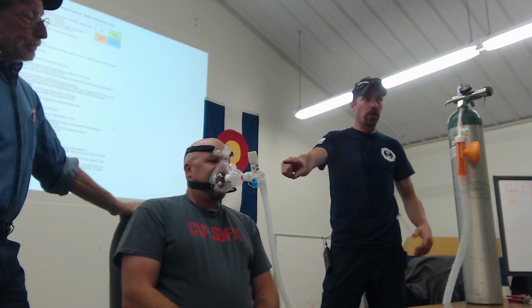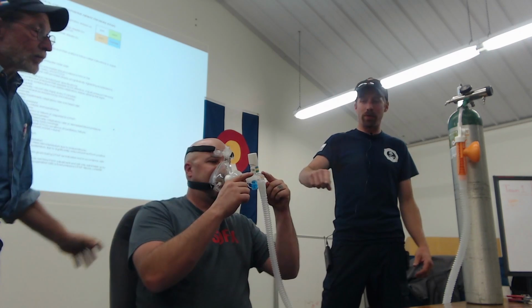And if you're counting respirations, this thing makes it super easy. All you got to do is watch that little PEEP valve. When it goes up, they're breathing out. And of course, you can watch the fog in there as well.